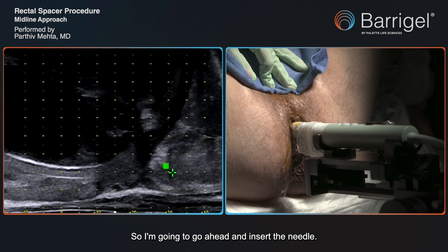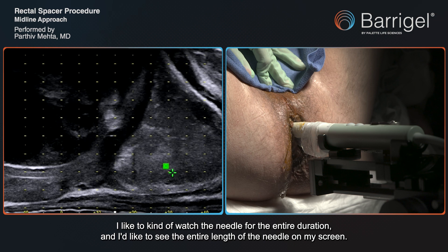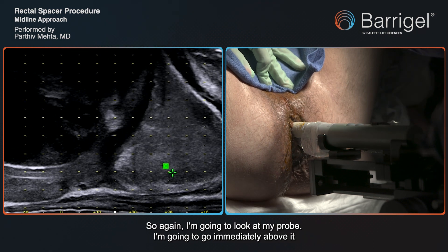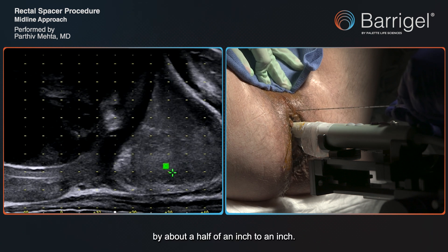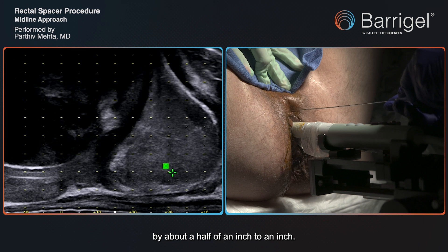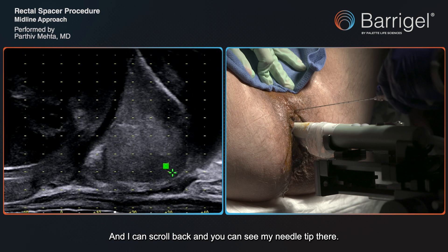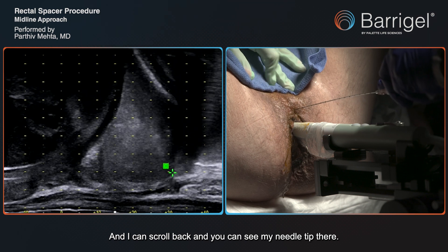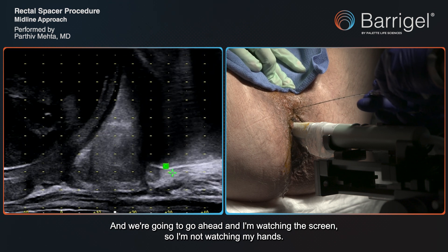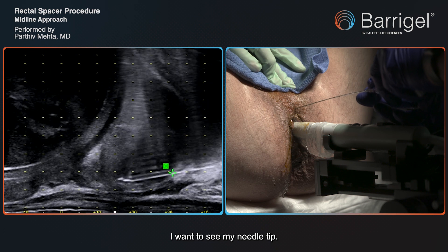I'm going to go ahead and insert the needle. I like to watch the needle for the entire duration and I'd like to see the entire length of the needle on my screen. I'm going to look at my probe and go immediately above it by about a half inch to an inch and pierce the skin. I can scroll back and you can see my needle tip there. I'm watching the screen — not watching my hands, just watching the ultrasound screen. I want to see my needle tip.